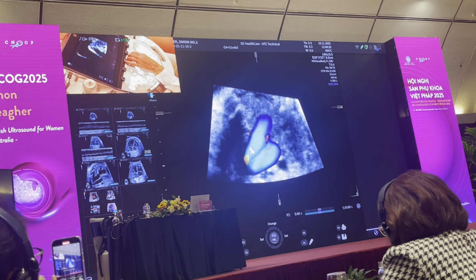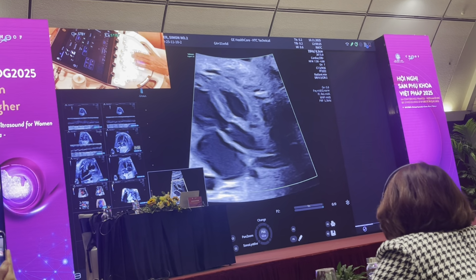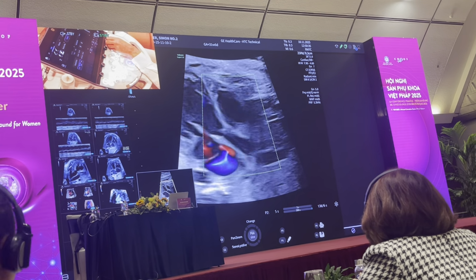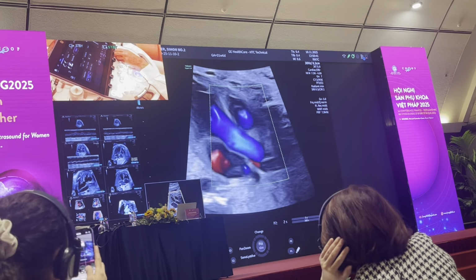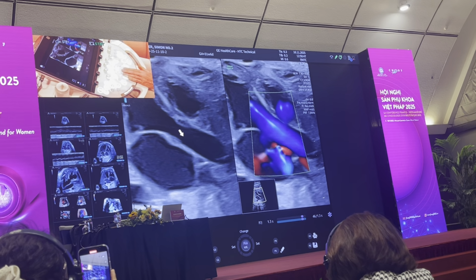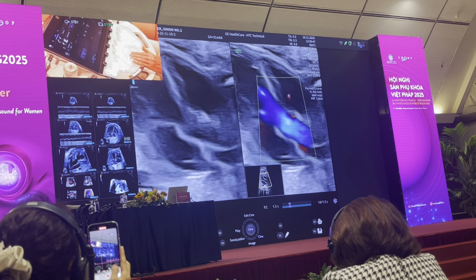Okay, good. So we just go back to the live scan, go back to checking that there's no aortic stenosis. When I'm looking at the left ventricular outflow tract, I turn on color. I'm going to now reduce my radius, and I'm going to increase my PRF, at 57, patient 31 weeks. And now my PRF is at 68, and now it's at 86. And now you see, once I get to 86, I have a much better definition of the left ventricular outflow tract. I can see on the left side the way the aortic valve opens and closes normally, and on the right side, I can see that I have laminar flow across the baby's aortic valve.